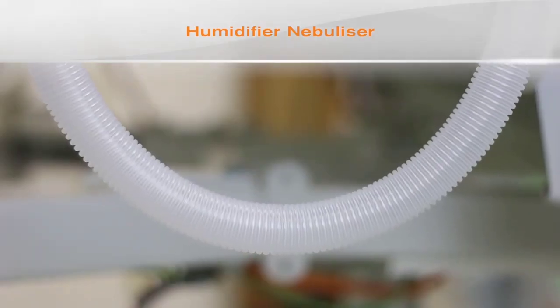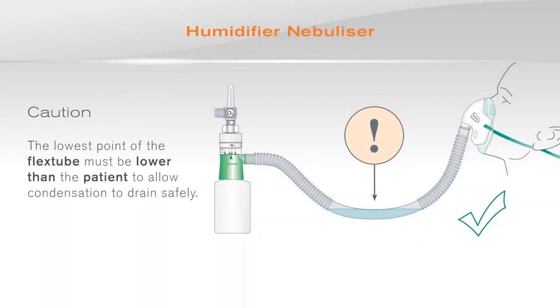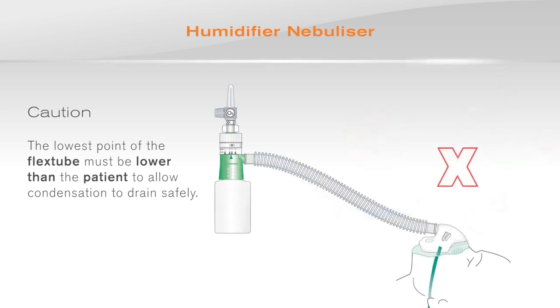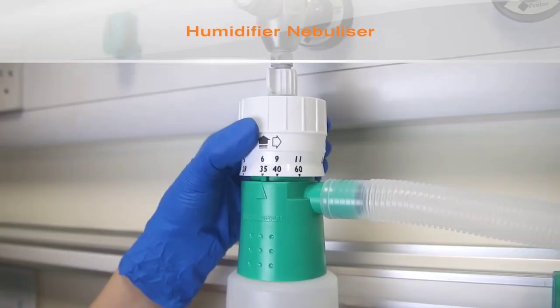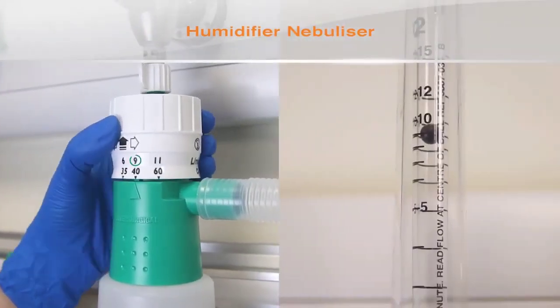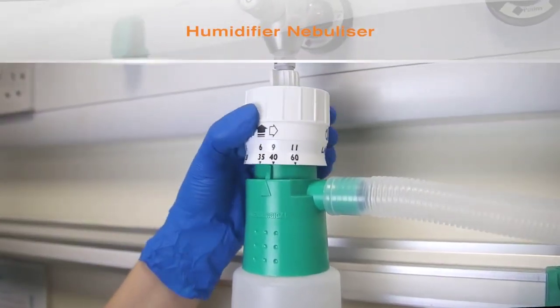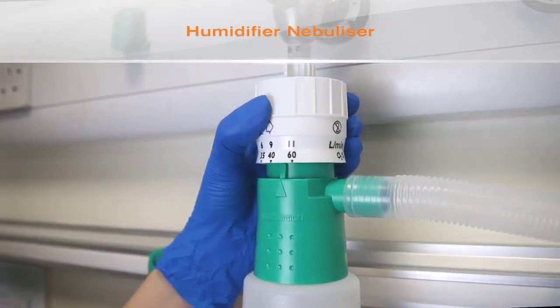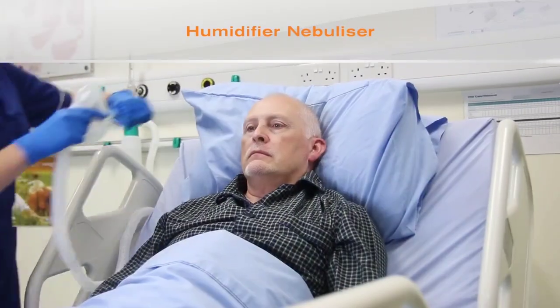It is important to position the tubing so that the lowest point is below the patient and to regularly drain any condensate to prevent any condensed water from running into the patient or occluding the flex tube. Attach the aerosol mask and then adjust the oxygen concentration to the required level. Set the flow meter to provide the required total flow to the patient. The Intersurgical Aquamist makes this simple by indicating the appropriate flow above each oxygen setting. Then fit the delivery device to the patient.